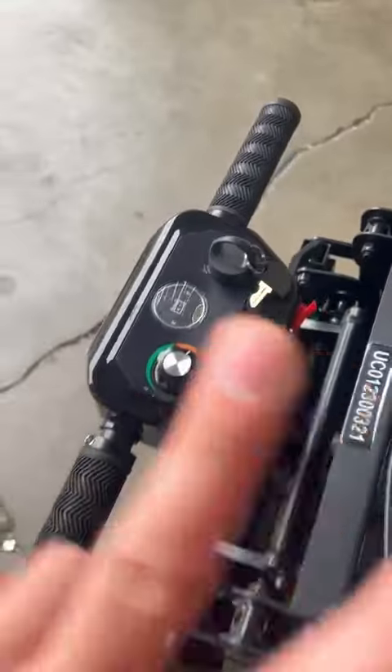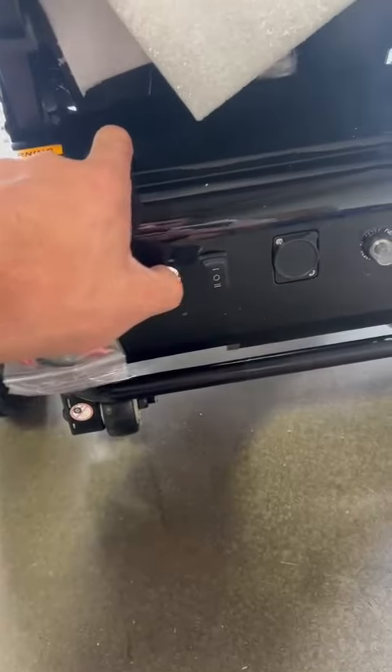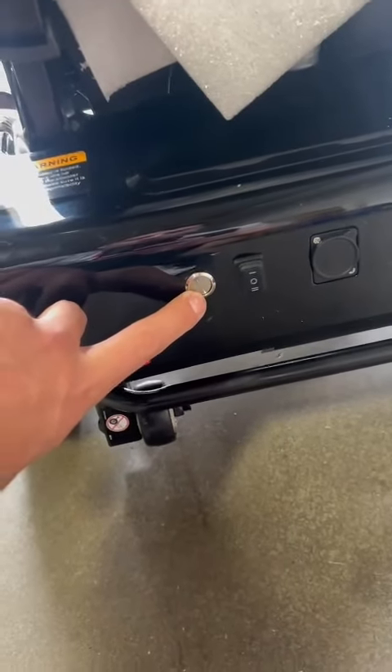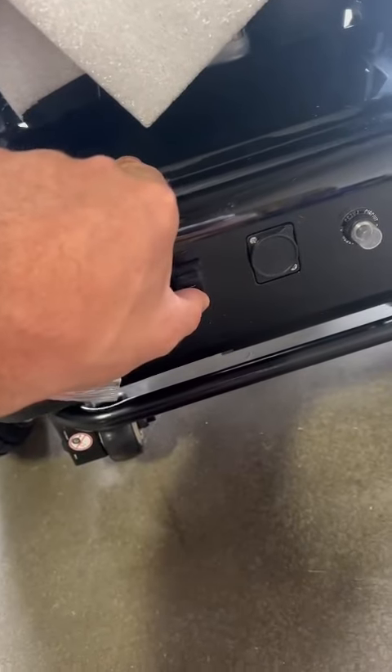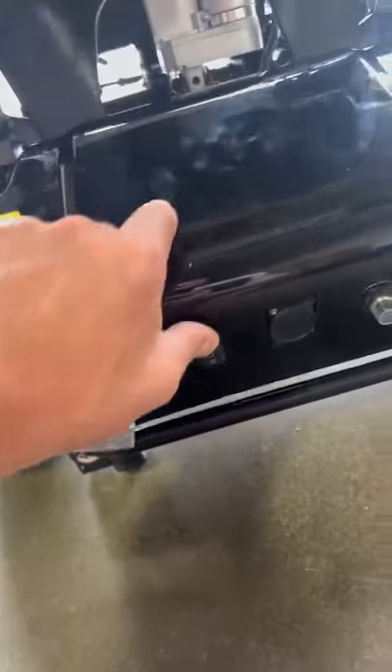Do not turn on the key. Do not. Second thing, press the metal switch. You can see it goes in short light. And then you can press like this — fold it or unfold it.